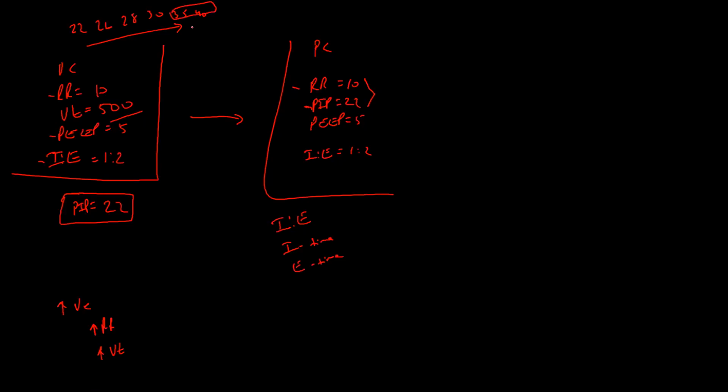And so what we do then is we say, we're going to switch from volume control to pressure control. And I'm going to set my peak inspiratory pressure, let's say at 30, because that's about as high as I want to go and be safe. And we're not going to go above that. So what that does is it protects the lungs from blowing a pneumothorax, because it's going to limit the peak inspiratory pressure at 30. However, it doesn't come without a cost.